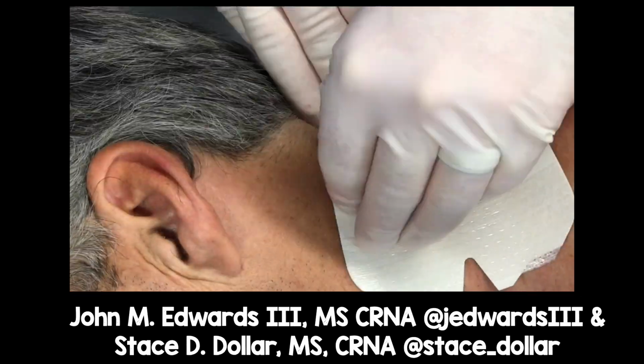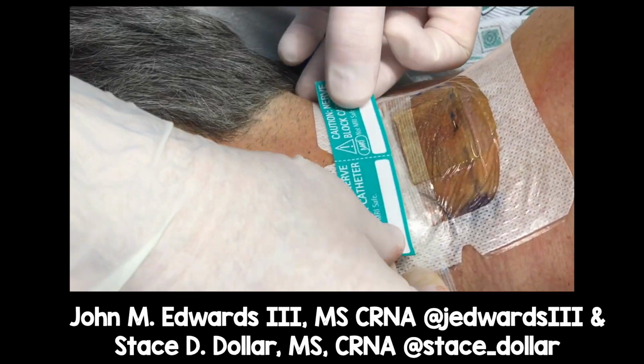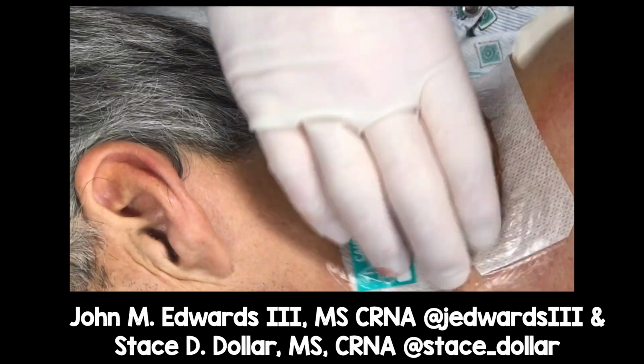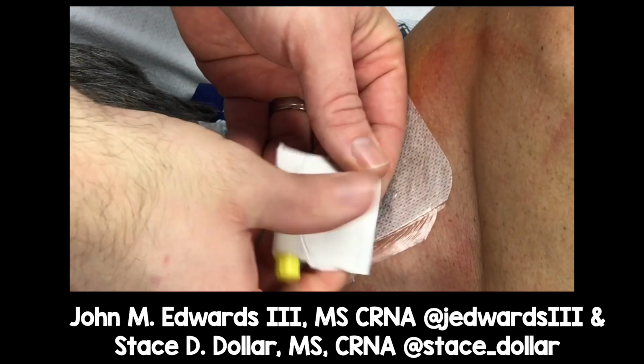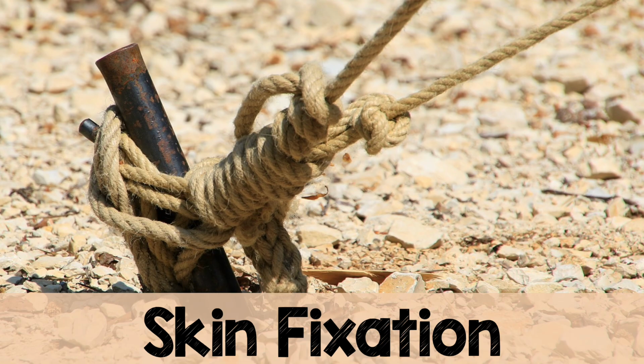And then there's a chlorhexidine impregnated dressing that goes on top of all of that, and then another sticky label and then another Tegaderm on top of all of that. That catheter is not going to go anywhere. The next step, they then put a coil on the catheter where it meets the connector over here to make sure that stays nice and firm, and that way that catheter is going to stay nice and solid.